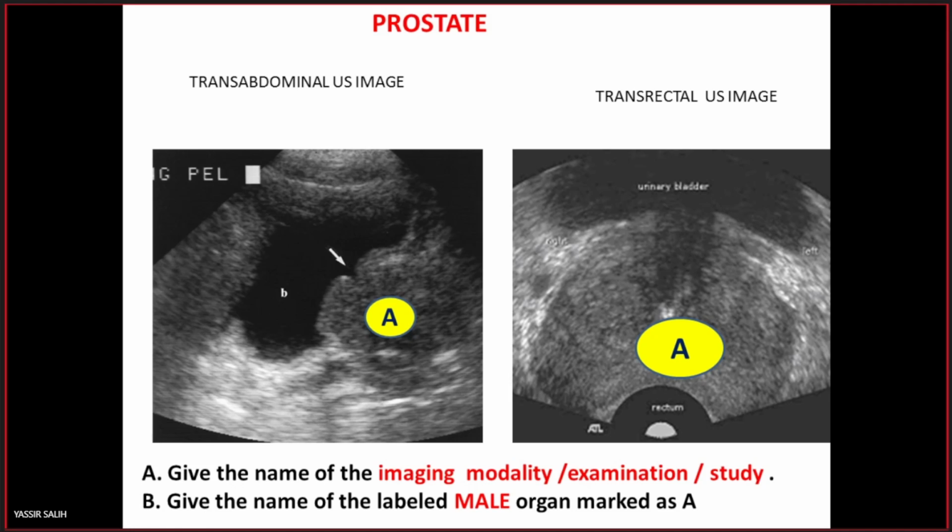Yes. The imaging modality in this one, ultrasound. The imaging study or imaging examination, transrectal. Transrectal ultrasound. Very good. What is this structure? Mark as A. This. Prostate. And what is this?